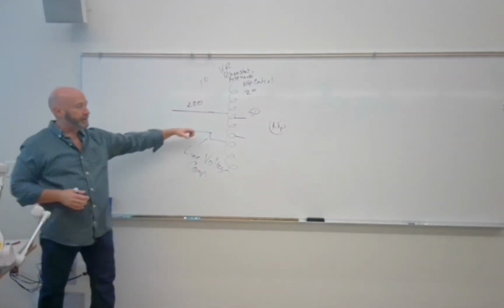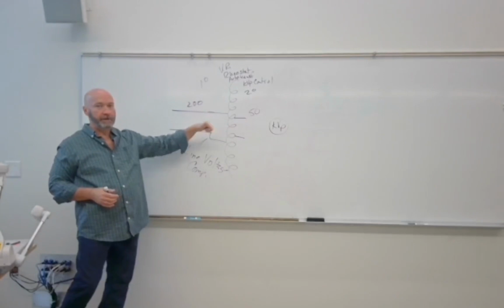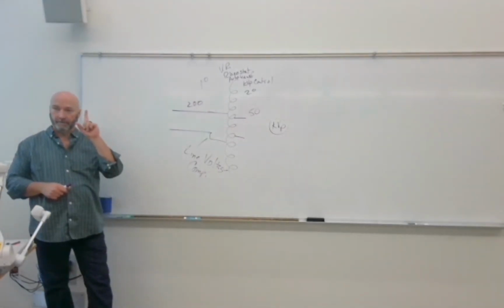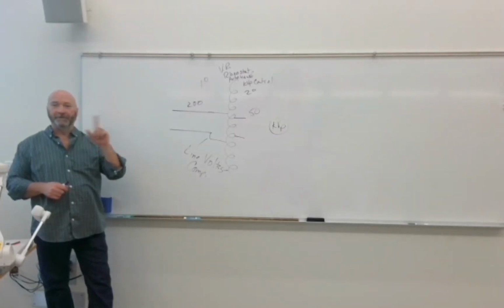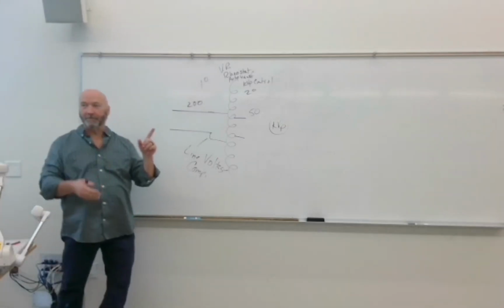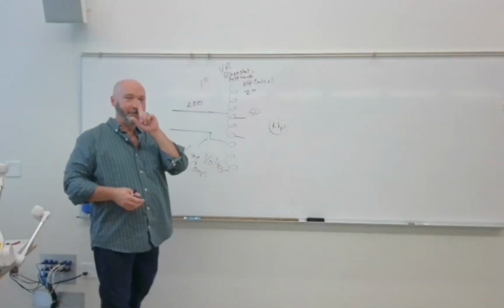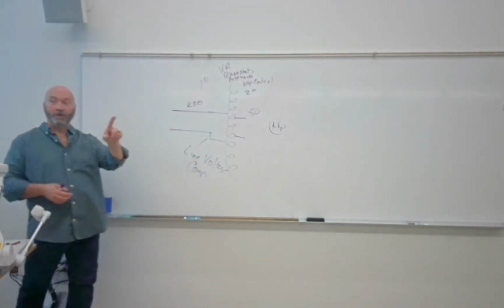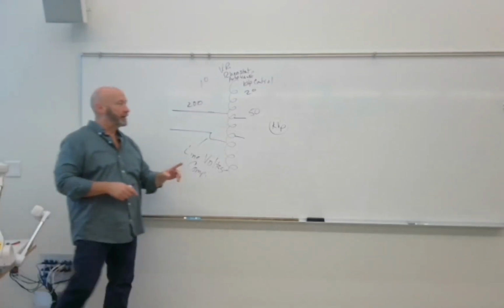What's a distinguishing characteristic of the autotransformer? As we just tested on this, y'all. You're starting to act like the sophomore students. They zip their mouth as soon as they come through the door. One coil. That's it. It only has one coil, right?